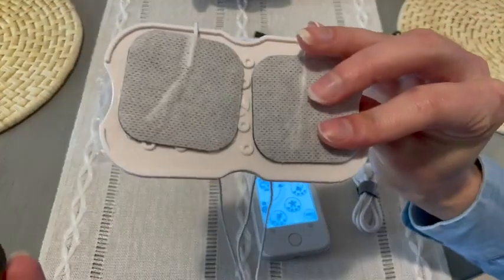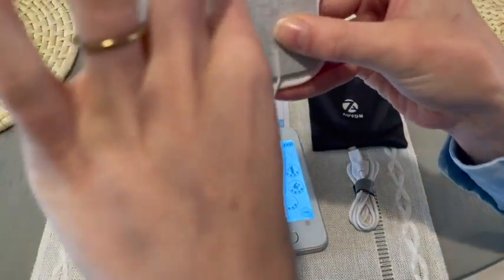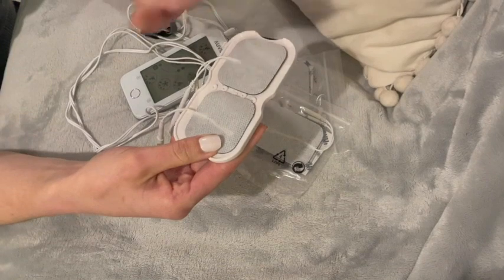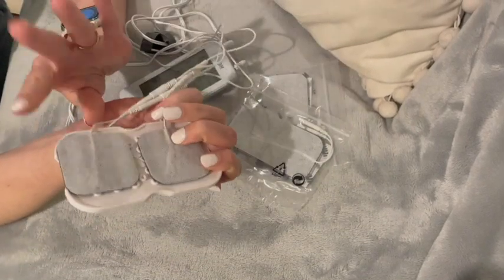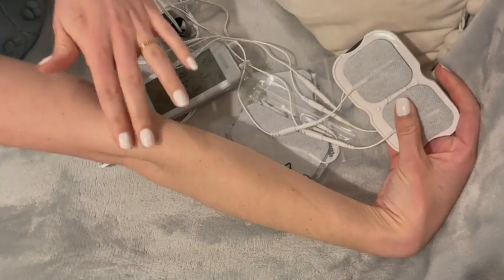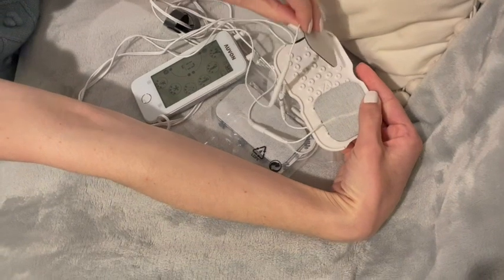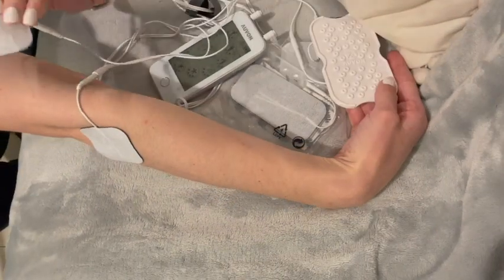You have two currents on this machine, A and B, and here I have them plugged in with the small squares. So here I have channel A and channel B. And so what you do with the two channels is, say for instance that I have pain right here in my arm. Then I would apply, here's channel A, one side of it, and on the other side.